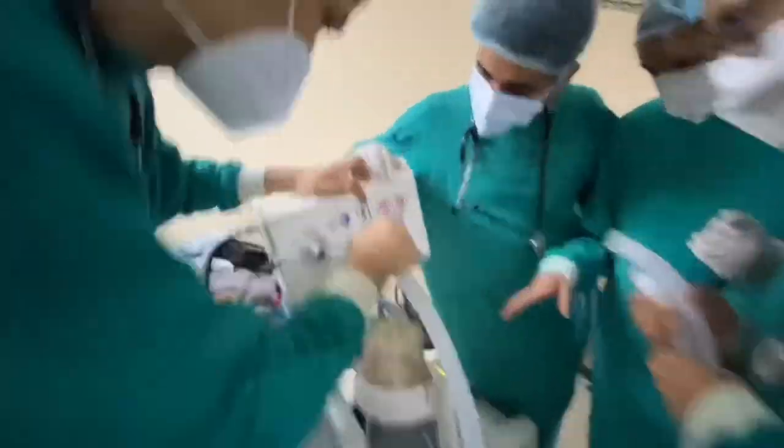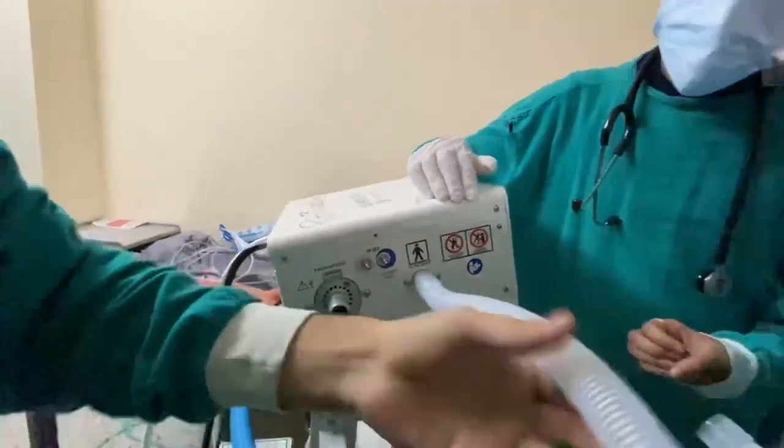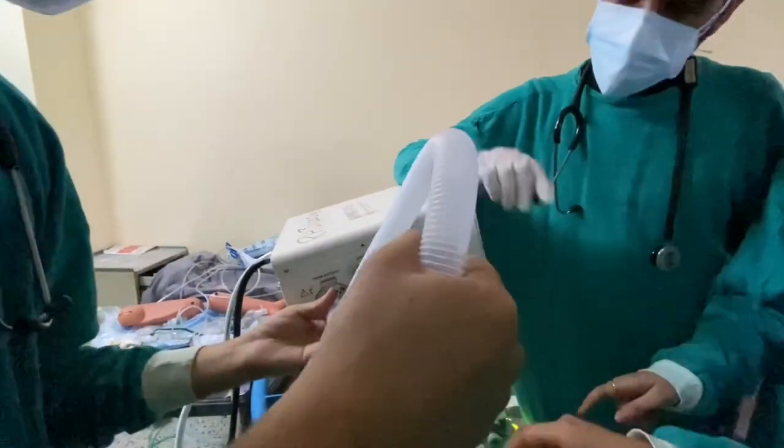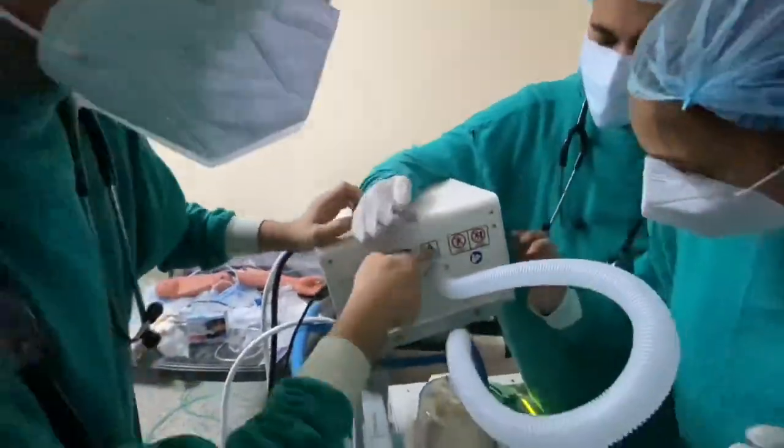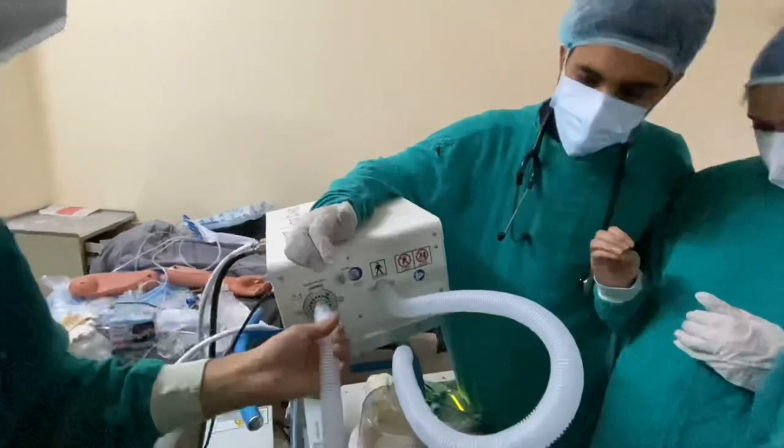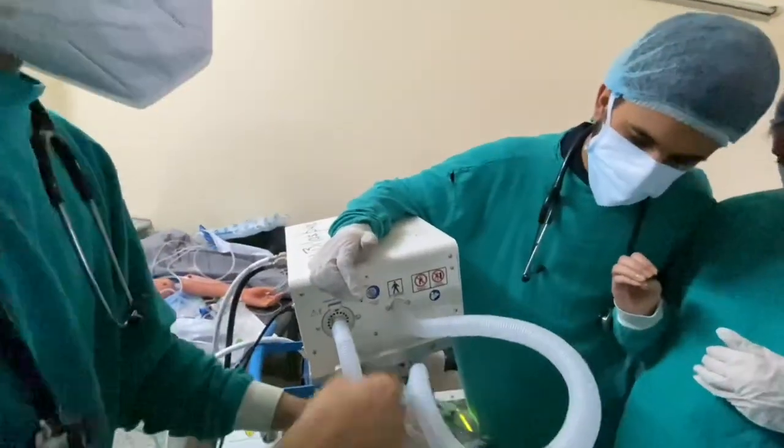Hi guys, I hope you all are doing well. I just thought of sharing something that I learned during my COVID training in the anesthesia department — that is the basic operations of a ventilator. So let's get started.